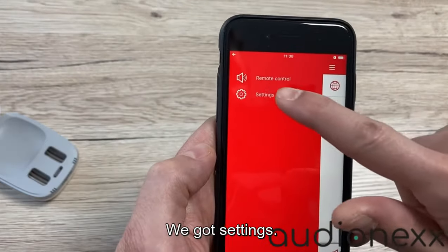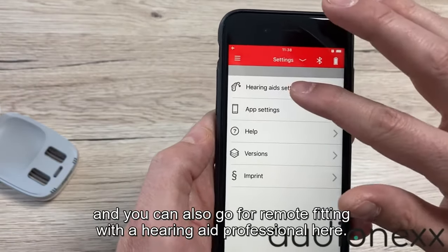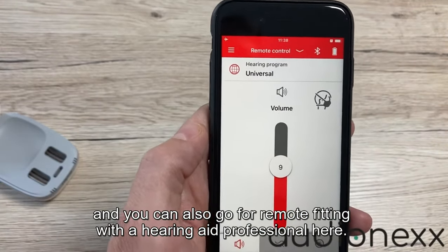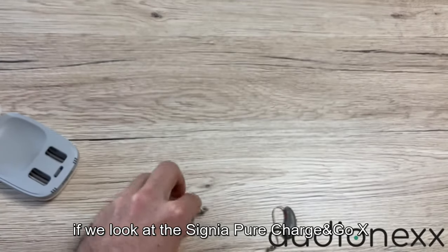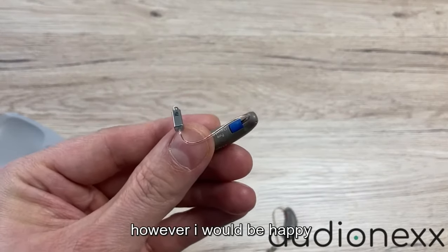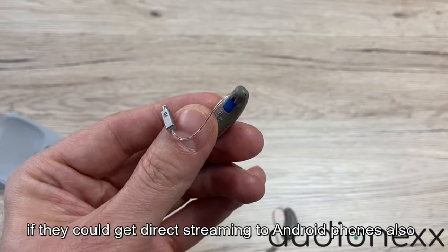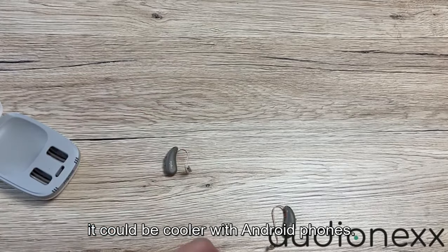In the settings you can check your hearing aid settings and the app settings. You can also go for remote fitting with your hearing aid professional here, which is quite nice. So looking at the Signia Pure Charging Go overall, I think it's honestly one of the best rechargeable hearing aids on the market right now. However, I would be happy if they could add direct streaming to Android phones as well, because that's still missing — it's cool with Apple, but it could be cooler with Android.